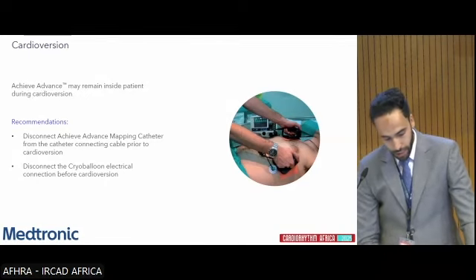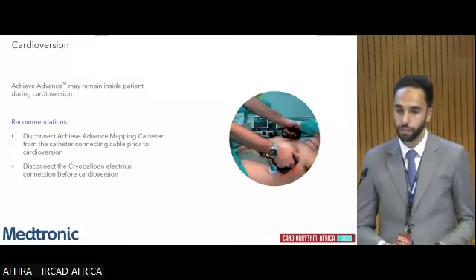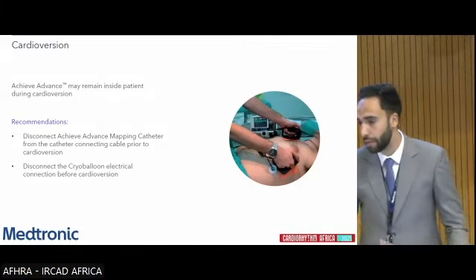The second recommendation is to disconnect the CRYO balloon electrical connection before cardioversion, and after you cardiovert, you connect the two cables to the Achieve and the balloon.